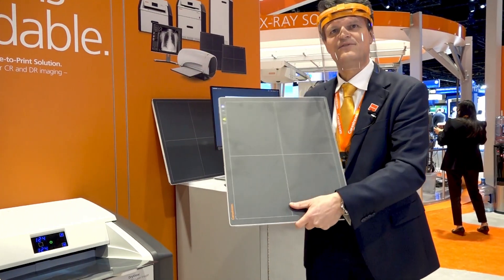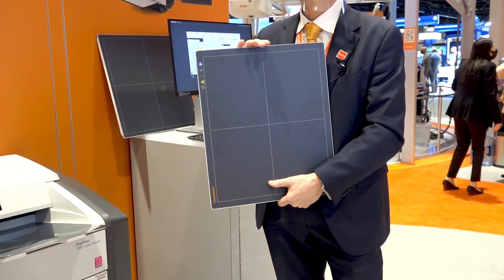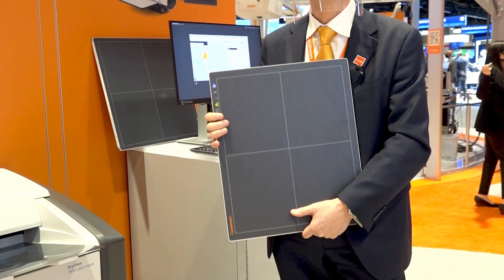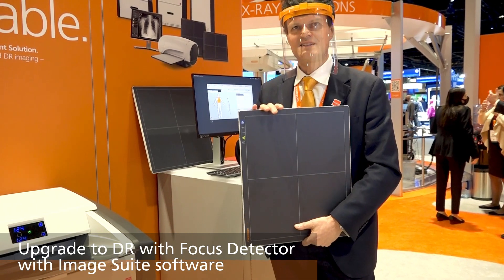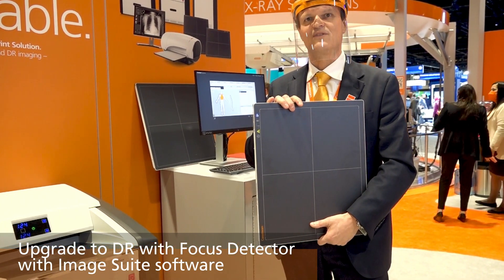The CareStream focus detectors are available in two sizes — 14 by 17 or 17 by 17 inches — both with cesium iodide scintillator for optimum image quality and lower dose applications. The wireless design also helps to minimize the infection risk and trip hazards of cables.